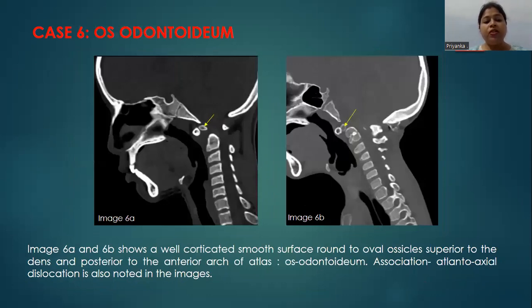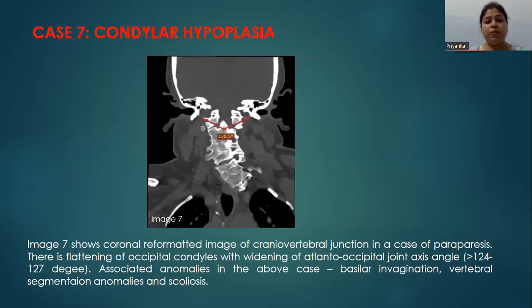Images 6A and 6B show a well-corticated, smooth surface, round to oval ossicle superior to the dens and posterior to the anterior arch of the atlas, suggestive of os odontoideum.